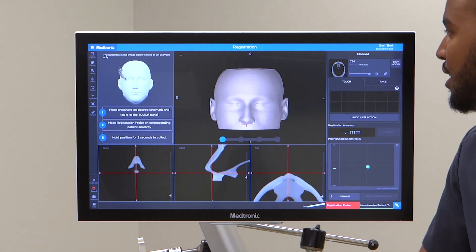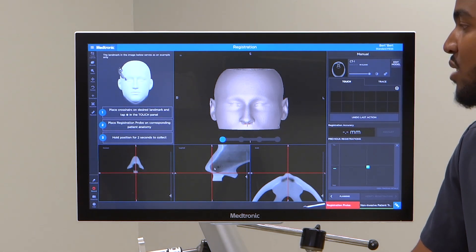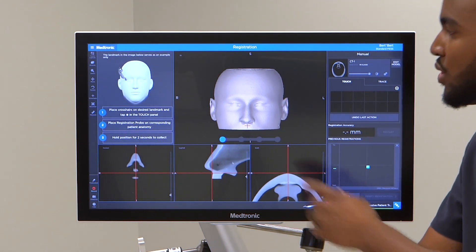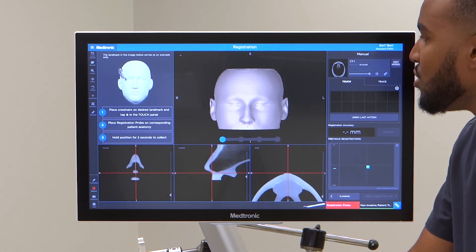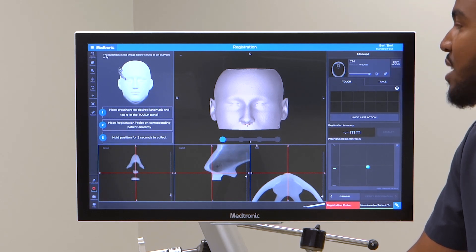You can touch anywhere. It's great to use a mouse for this — you can also touch the screen with your hands. I find that using a mouse is typically easier, at least for me.